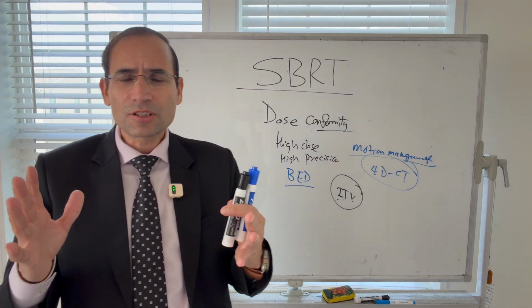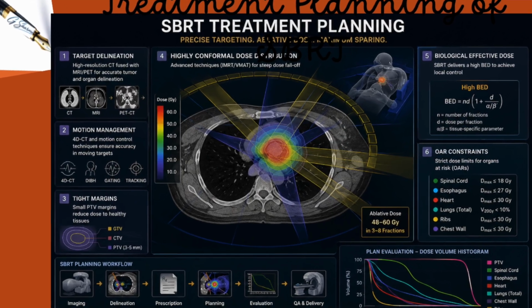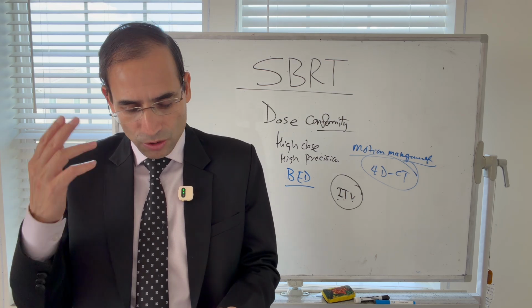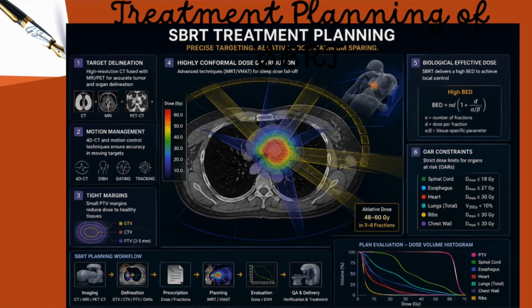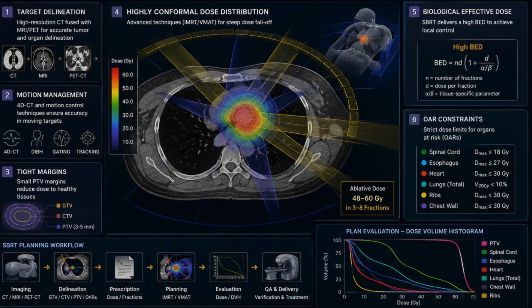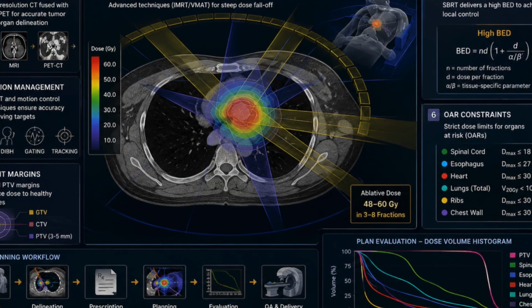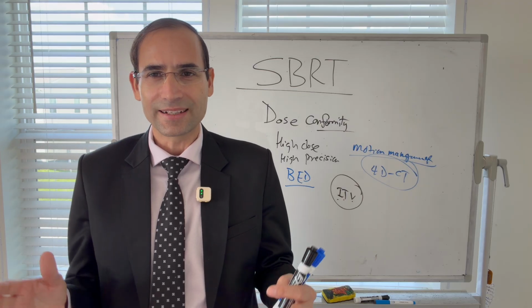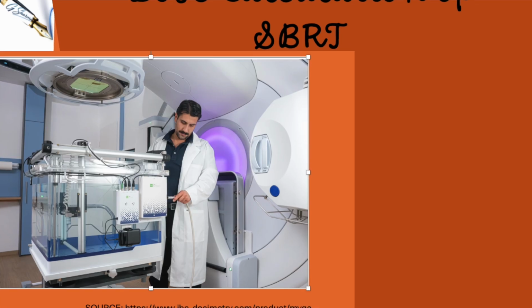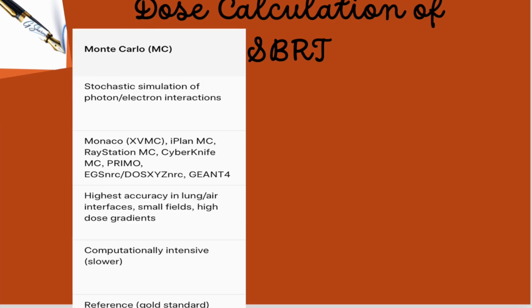Now the next comes treatment planning. That's the critical point here. So where is the physics really science here? I would say we contour the tumor, we contour the GTV, the ITV, the PTV, right? We design the beams using IMRT or VMAT. That's how the physicist is very critical in the radiation oncology field. Advanced algorithms like Monte Carlo, which we call MC, calculate the dose accurately.